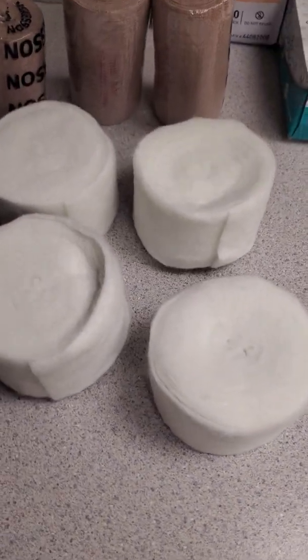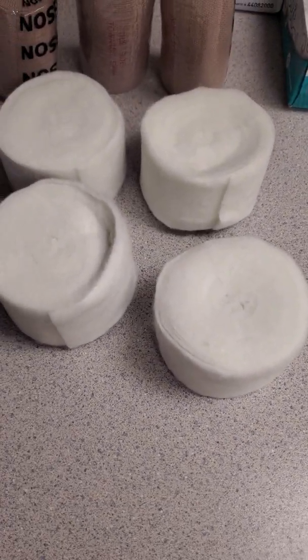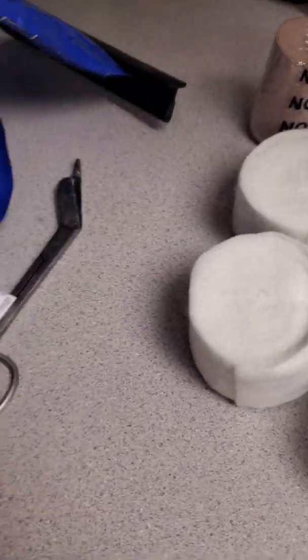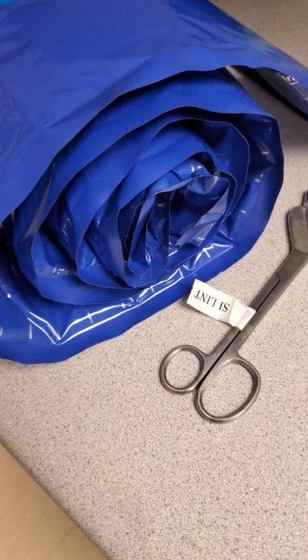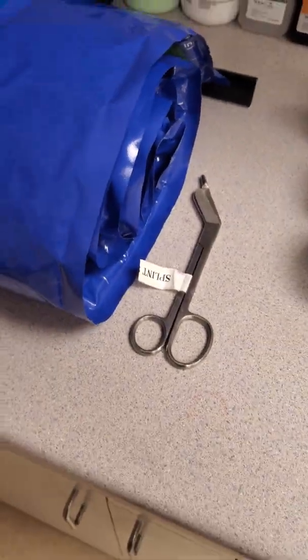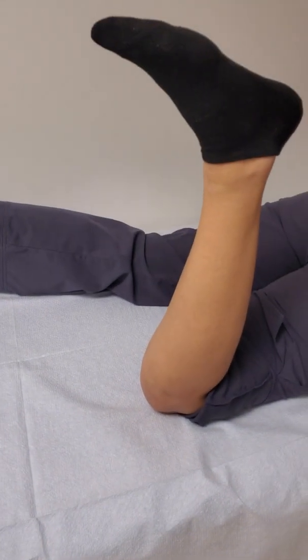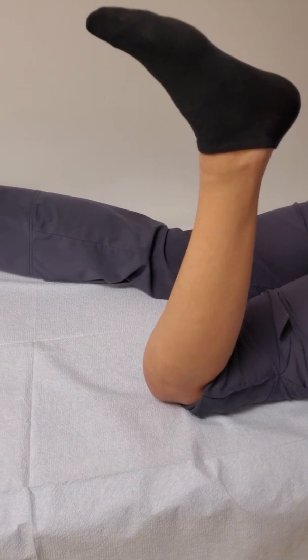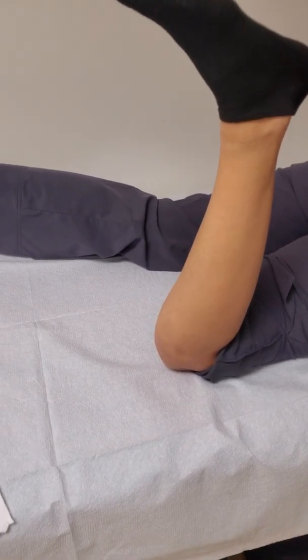So we'll go ahead and get started using these materials: basic cast pad — or in this case, splint padding — cotton web roll, ace wraps. We're going to be using the three-inch ortho glass, and we can do this with plaster too if we want. Some scissors of course. We'll be using one of the staff members with their permission as our example.